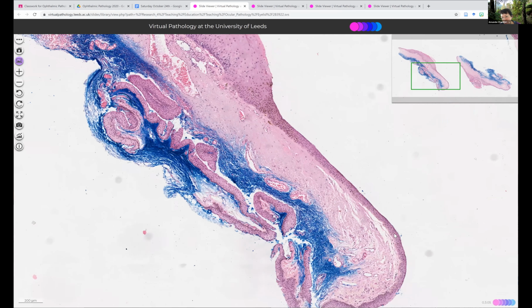Actually, what's that up there? With parakeratosis on the surface. And here we go. We can see quite an abrupt change. This is normal on the left here. And then you see there's almost a line here where it becomes abnormal and the color changes. So I think this is a squamous dysplasia.